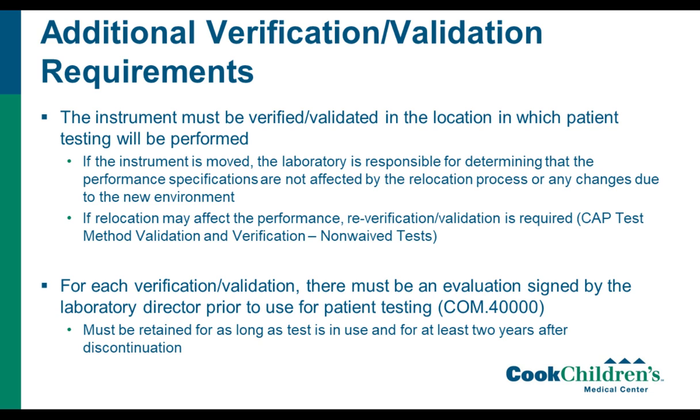For each verification or validation that's performed in the lab, there must be an evaluation that's signed by the laboratory director prior to use. This is a summary. We also, in our lab, put all of the data with that as well, in a binder, and that must be retained as long as the test is in use and for at least 2 years after a test is discontinued. So make sure you have all of those documented, and then some CAP inspectors come in and like to look at the validation verification summaries.